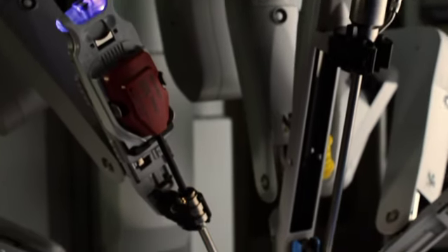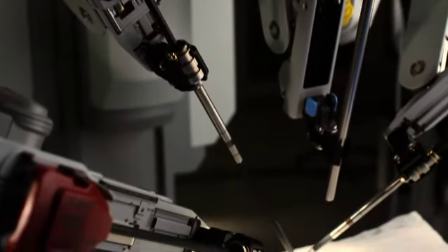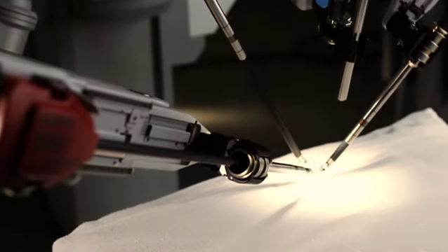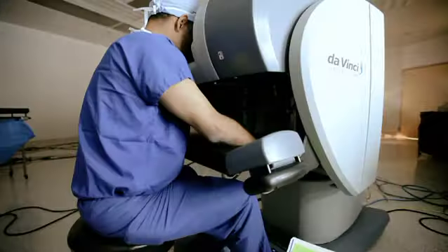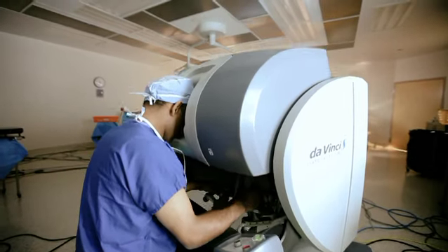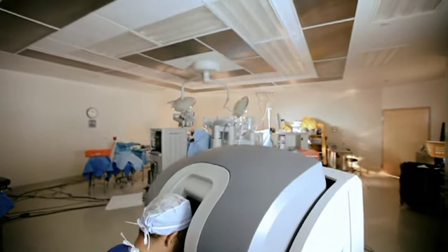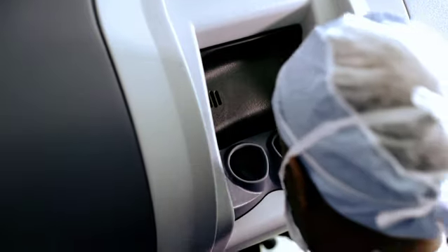The da Vinci enables surgeons to perform complex procedures through small incisions with unbeatable parallel dexterity, precision, and control. With the da Vinci, the surgeon sits in an ergonomic console just a few feet from the patient and views the surgical site through the three-dimensional viewer.